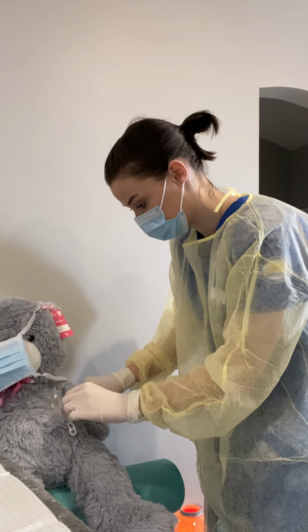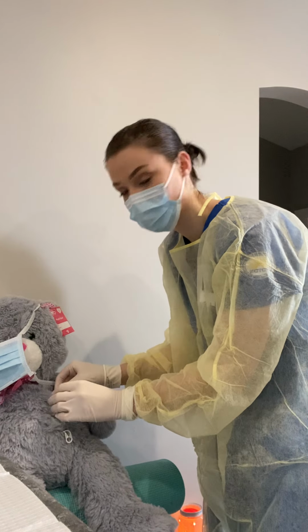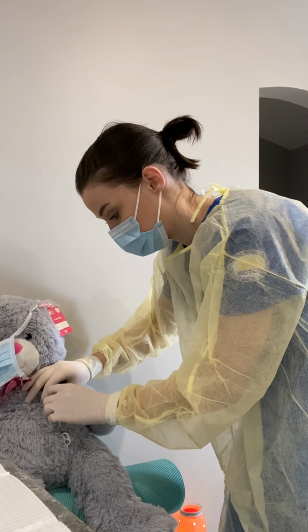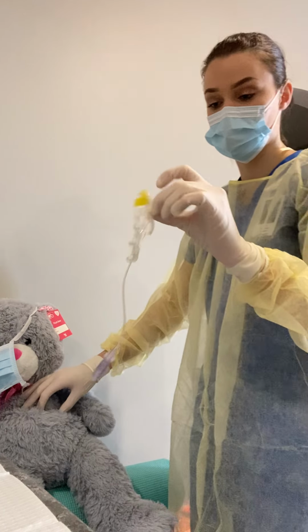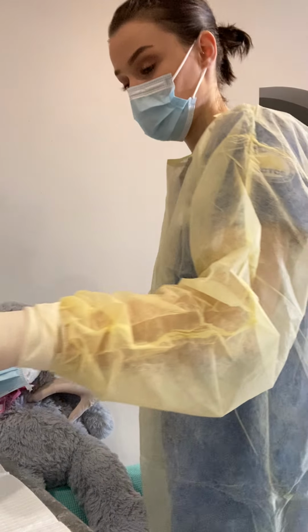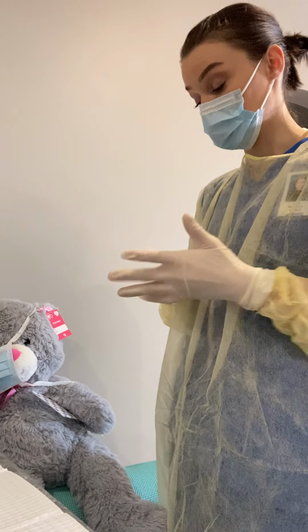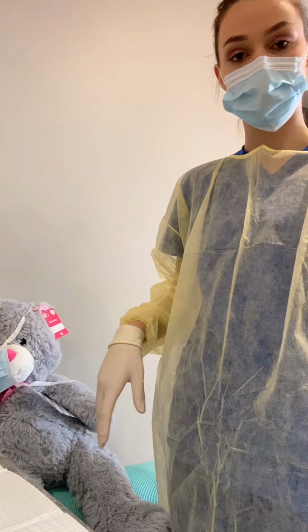All right, so we got that dressing pulled back. It's quite hard on a fuzzy patient. When I pull out my needle, I'm probably going to get a little bit of pressure, and I'm going to pull out at a 90-degree angle and discard this per my facility policy. I'm going to take my Tegaderm and place it right over that area. Bandage it per my facility's policy. And then I'll chart what I did.